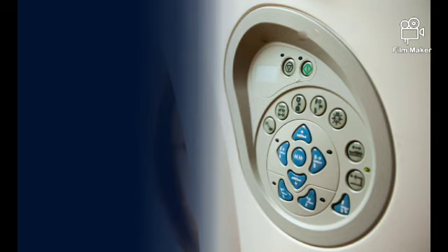Okay, so that is in the center point. You can see this is the first point. If you are pressing here and putting any of the four keys, your table movement will be very fast compared to regular movement.